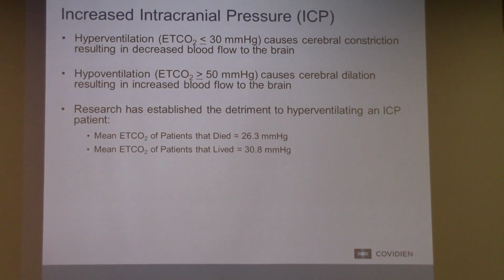What I like about this study is this is a pre-hospital study. So this was done at the doors to the ER. So the paramedic team, EMTs would say, I'm bringing in an ICP patient. Researcher would meet them, or they may have done it retro. I'm not sure if it was active or retro. But they looked at what's the arriving end-tidal CO2 of the ICP patient over several months. And then they tracked all the patients that died versus lived. I think they defined lived as at least returning to part-time work. They qualified lived beyond just sucking on a straw.